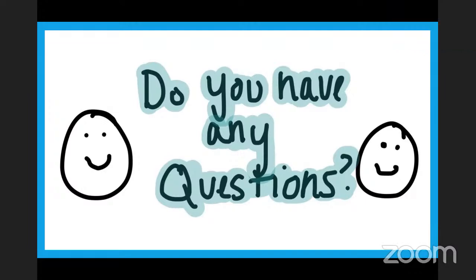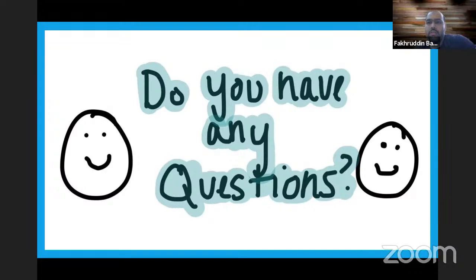Similarly, the next question is from Mr. Harry, who wants to know what is the ideal follow-up we have to recommend to the patient in case of using things like enzyme cleaner or hydrogen peroxide system. There would be no difference in terms of follow-up. I recommend normal follow-up. The first follow-up, I would normally recommend the patient to come back within 2 weeks, the first aftercare. And then I would follow up the patient at 1 month, 3 months, 6 months, and so on.